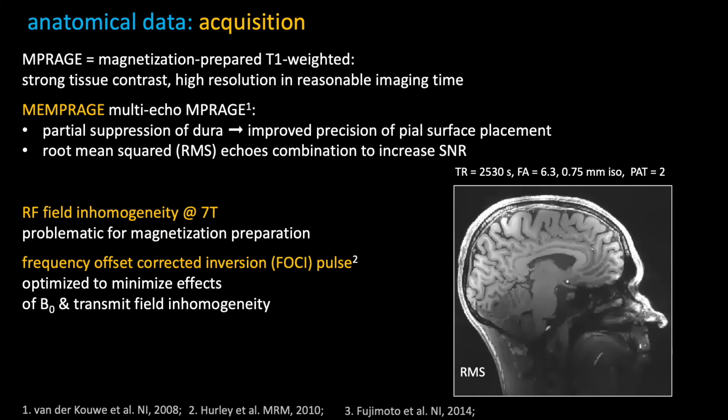And since this question already came up here, this last reference on the slide is actually a paper that compares MP2RAGE with the multi-echo MPRAGE, specifically for surface reconstruction with FreeSurfer. So anyone who is interested in learning a little bit more about that, I highly recommend reading this paper.